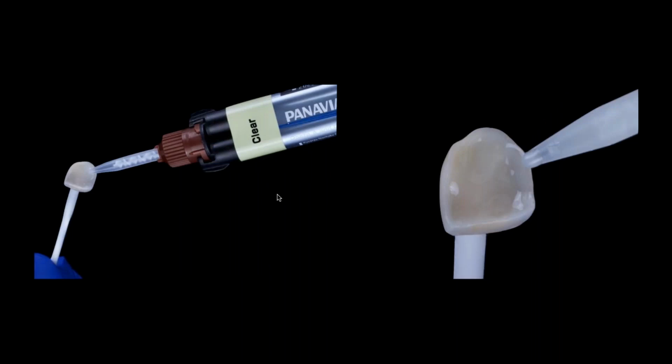So we apply the same cement as we did with the try-in, which is in this case the clear, and it's very important to have the full intaglio surface covered with cement. I'm not saying that you need to put excess of cement that goes around the entire restoration, but you need to make sure that it's very well distributed within the intaglio surface. So when you place the restoration, you can have a nice flow of excess around the entire margin, and that's what will assure us that we have a nice seal of that restoration.